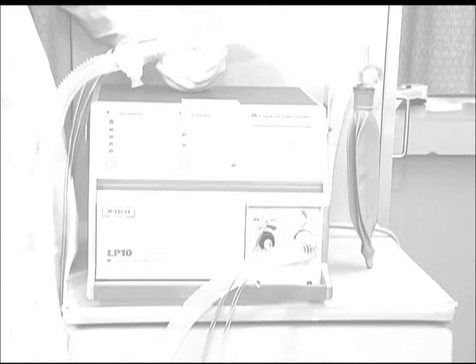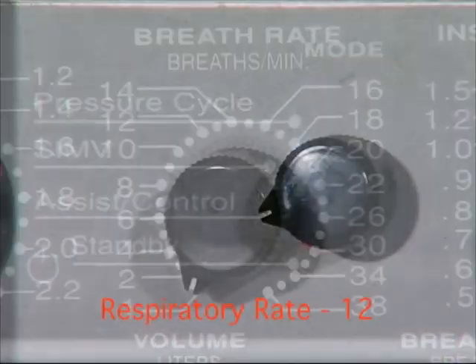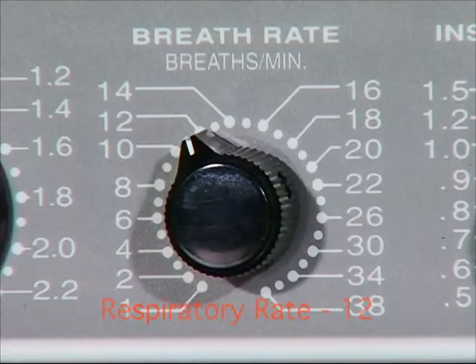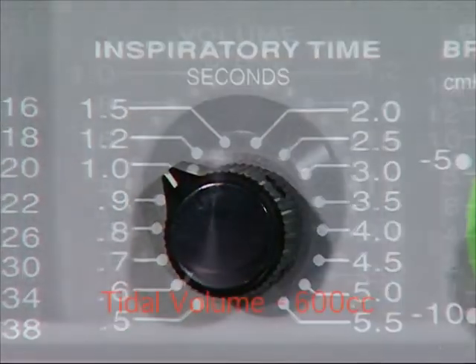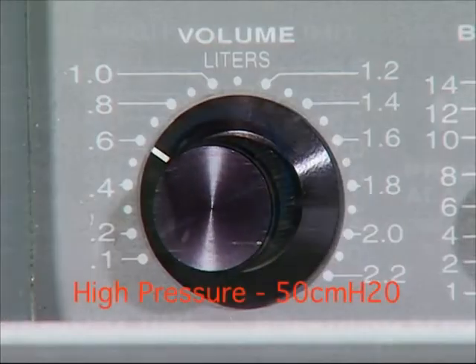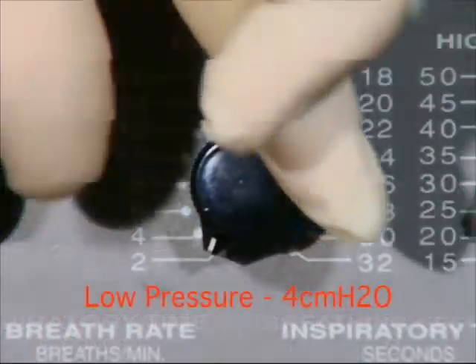Preliminary settings should be dialed in to assess proper function of the unit. First, attain prescribed ventilator parameters from the physician or appropriate care provider. If the unit is simply being checked for proper function, use the following settings: mode AC, respiratory rate 12, inspiratory time 1 second, tidal volume 600 cc, high pressure 50 centimeters of water, low pressure 4 centimeters of water.